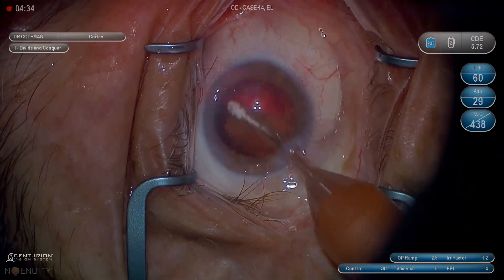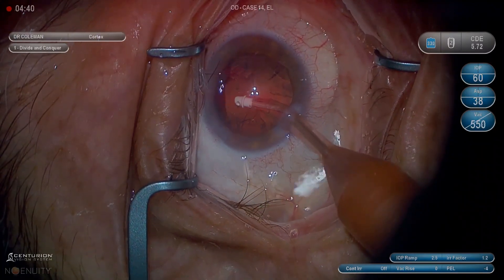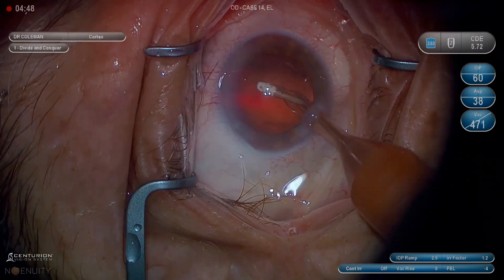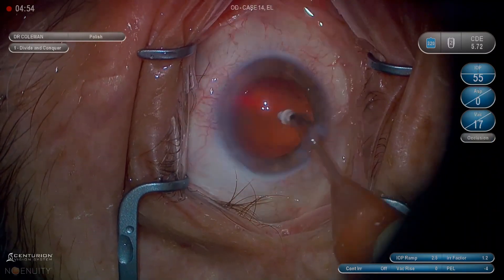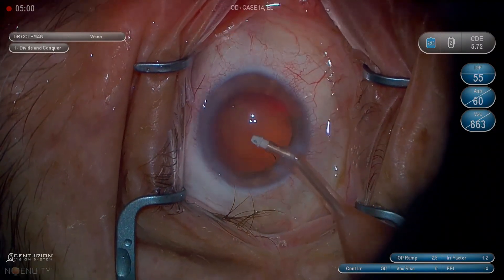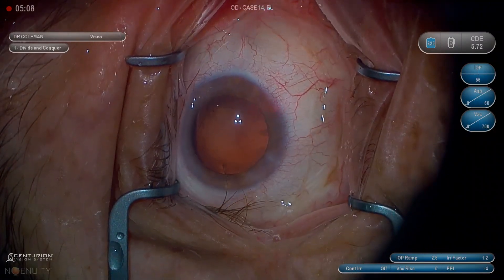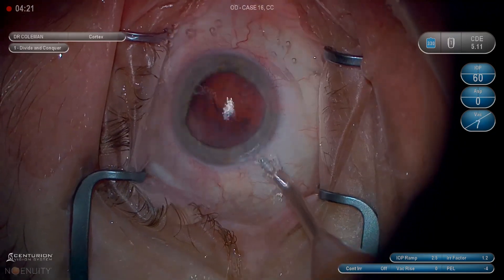After you engage moving in an arc and a sufficient amount is engaged — probably a few clock hours, ideally close to quarters — we push down, then pull central, then pull up, adding vacuum the whole time with the foot pedal to keep it from disengaging from your port. Sub-incisional cortex can be removed after the lens is in too, so don't get too hung up on it. I'm going to talk through the next few cases as they're occurring on screen.